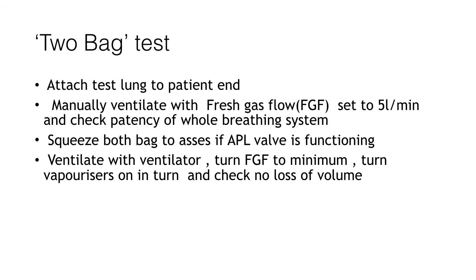Ideally, when a breathing system is not being used, you should protect the breathing system with the test lung, which prevents entry of foreign bodies into the breathing system.